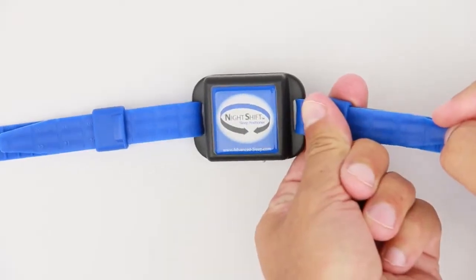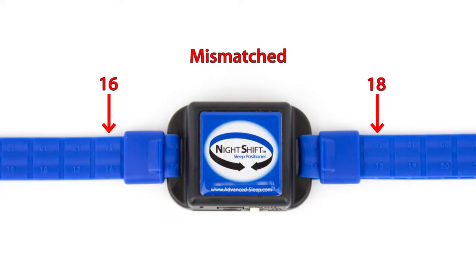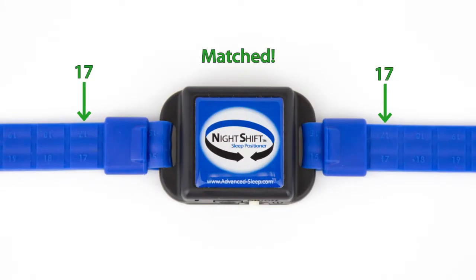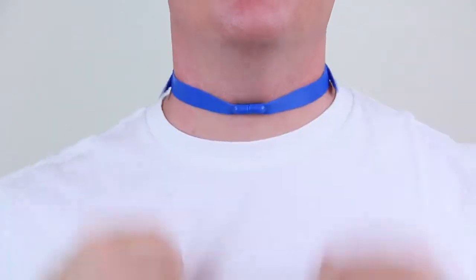Slide both retention bands against the device. The reference numbers should be the same on both sides. If the numbers don't match, tighten the side with the larger number and loosen the side with the smaller number until the reference numbers match.